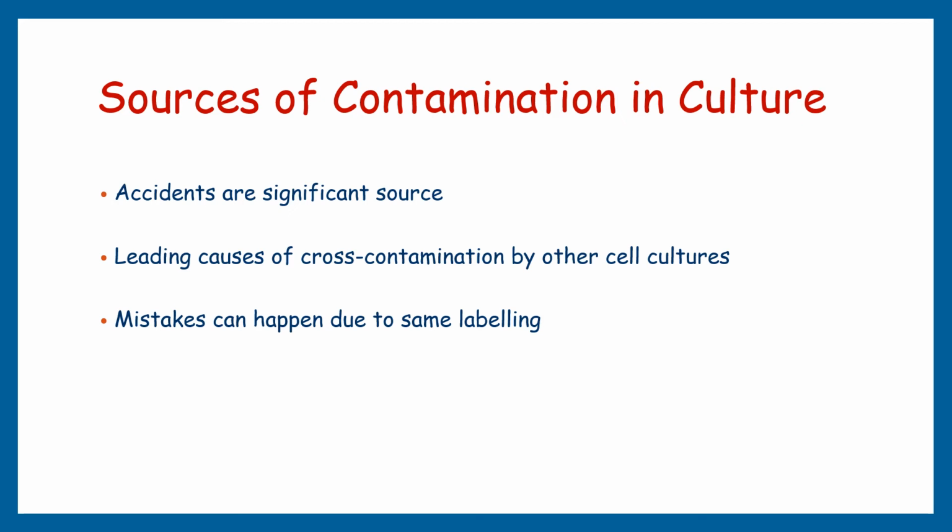Another example: two separate research laboratories, both attempting to develop cell lines from primary cultures, shared a walk-in incubator. One lab used the acronyms HL1, HL2, etc. to identify the primary cultures derived from human lung cell line. The other lab worked with cultures derived from human liver, but they too unknowingly used identical coding systems.